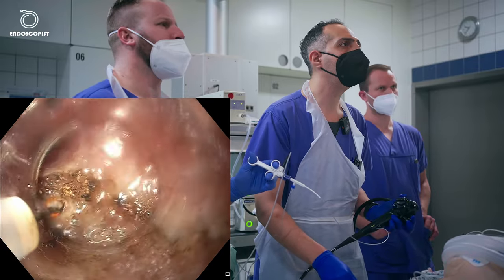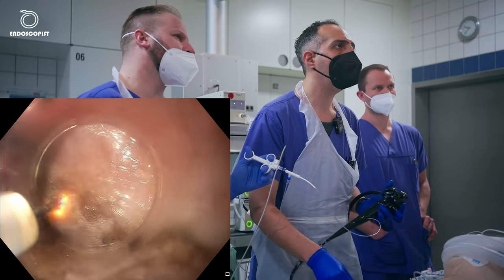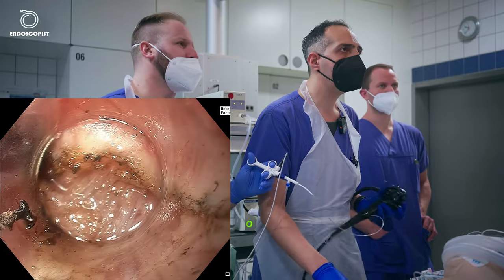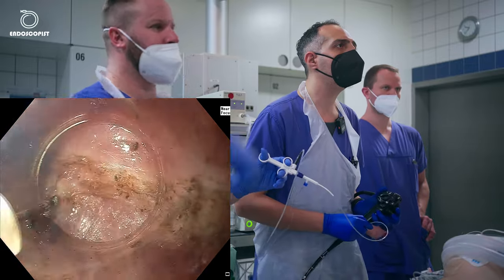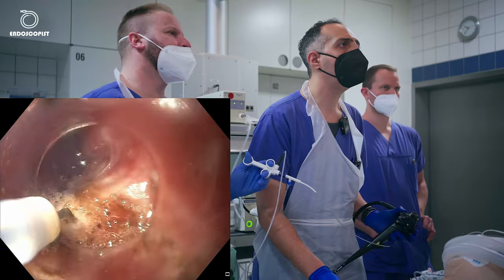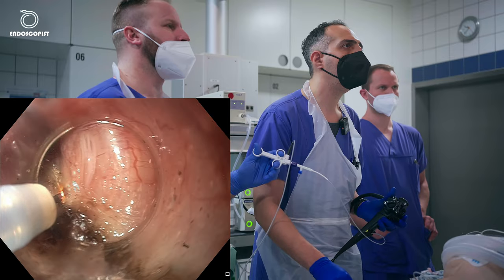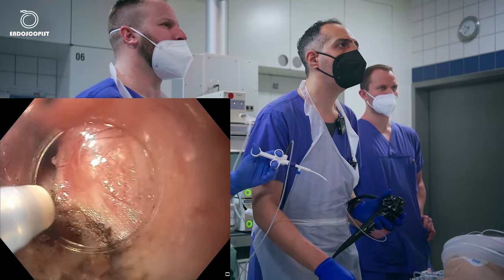We have a big vessel again. Sometimes I use near focus mode just to check the pattern of the fiber. We still have some muscle fibers here, but we can refine all of this afterwards. It looks fine. It still looks fine. Very good. Here is the cardia. Here is our main bulk of muscles.